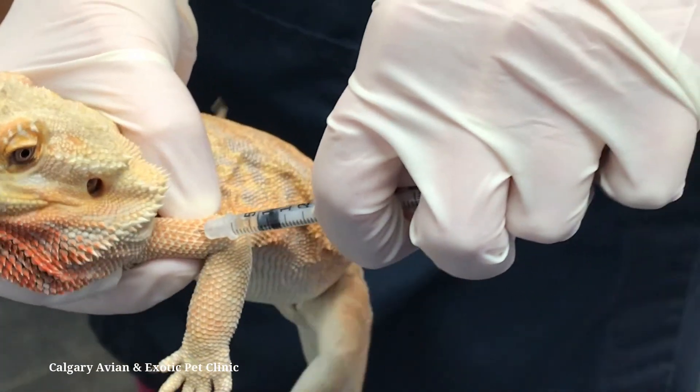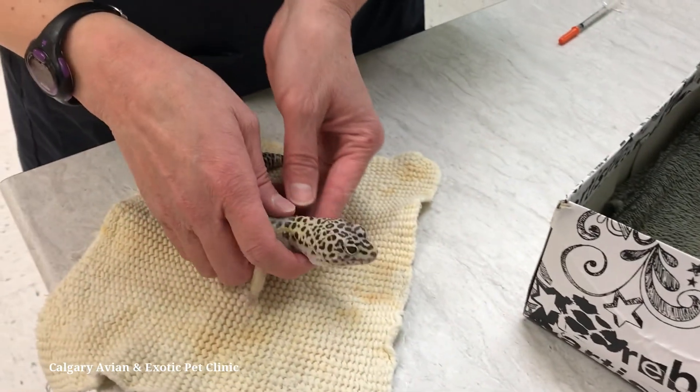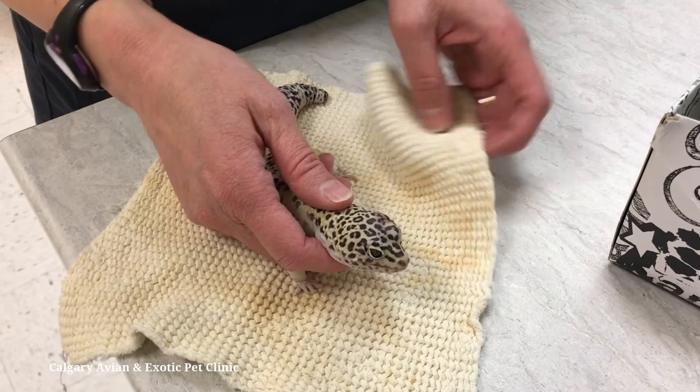If you do not see blood, give the injection. If you see blood, take the needle out and retry in another area of the muscle or in the opposite front arm.